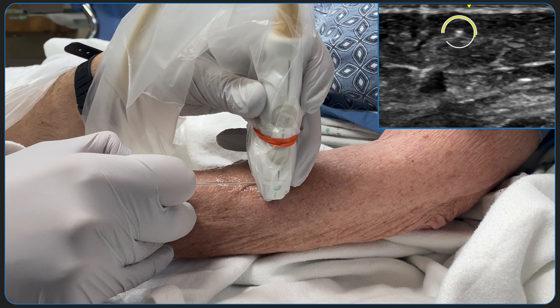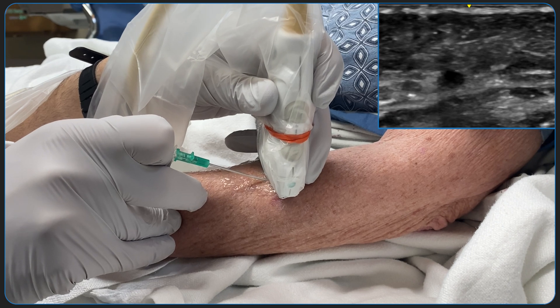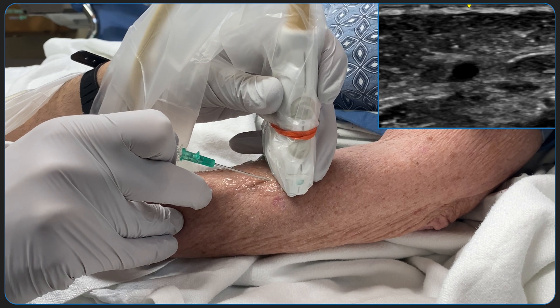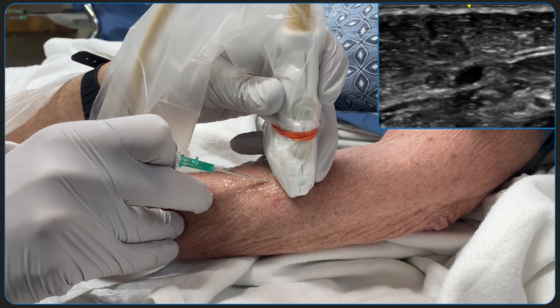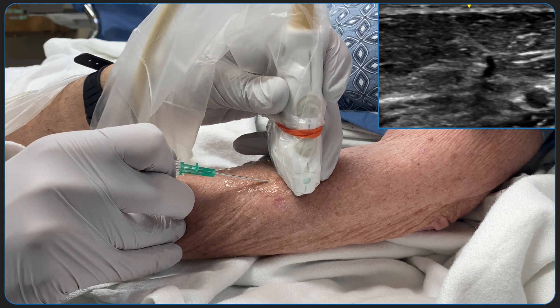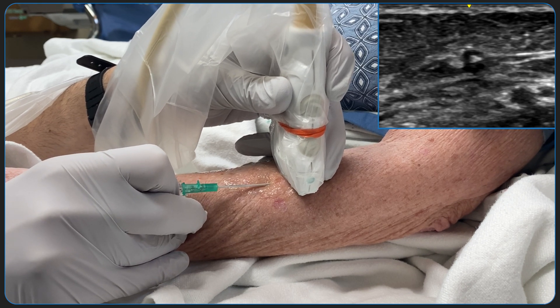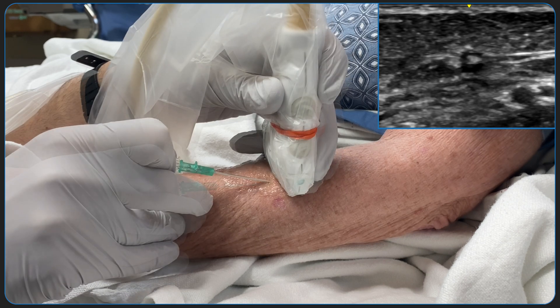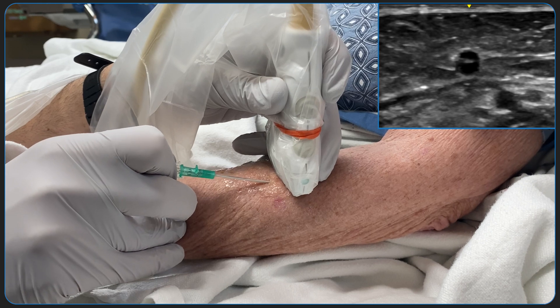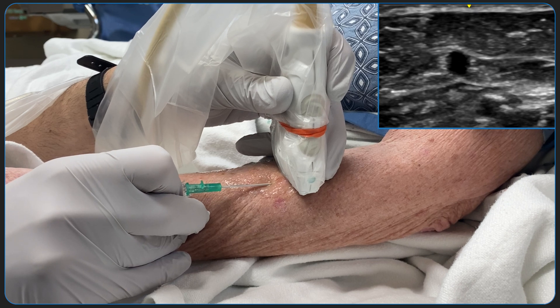The tip of the bevel can be seen medial to the vessel. Small sideways movements of the hub are then performed to position the bevel directly above the center of the vessel. With the tip positioned exactly above the vessel, the bevel is introduced into the lumen of the vein with a subtle jabbing motion. The body of the bevel is seen as bright and hyperechoic in the lumen. As the transducer is translated proximally, the size of the object becomes smaller and smaller until it disappears. Again, the smallest observable part is the tip of the bevel.